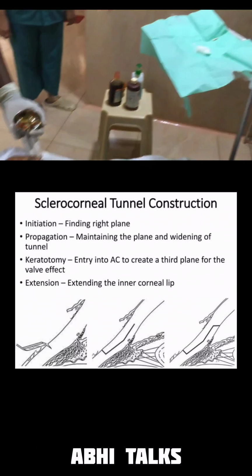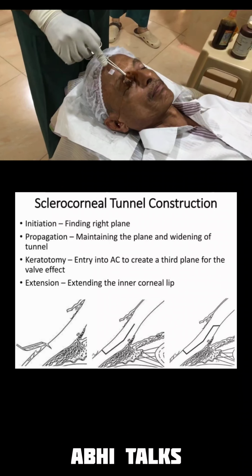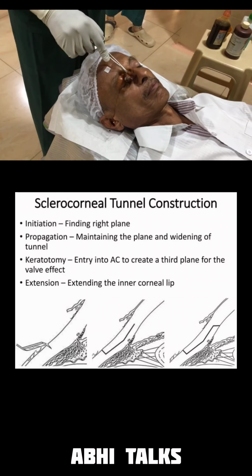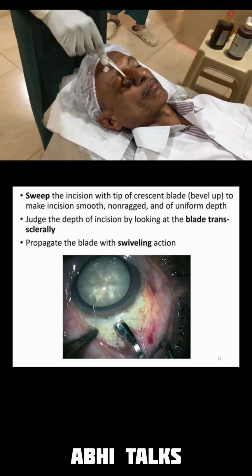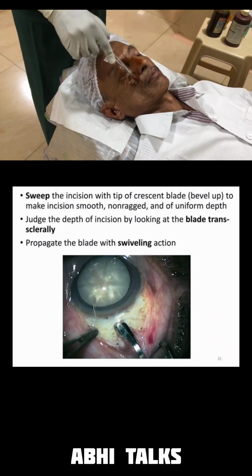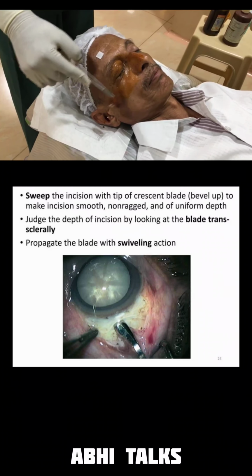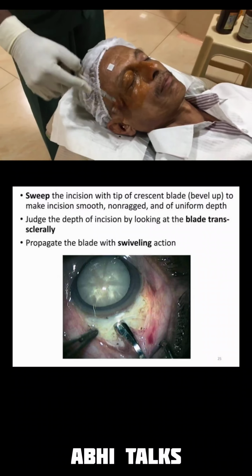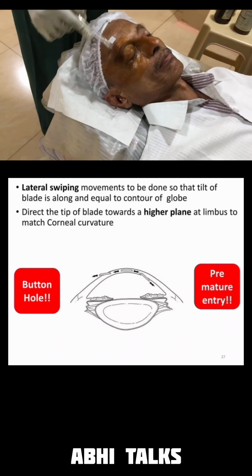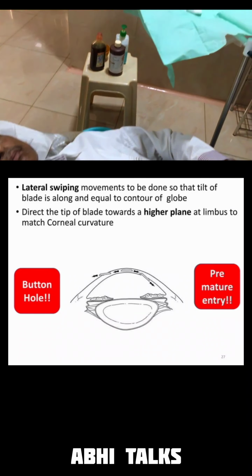Four cotton balls. One is kept dry there, one swab stick, and the eye is kept closed and starting from the central area, the lid margins, lashes, upper lid, lower lid, and circumferentially we will go from center to periphery to clean the entire eye and skin around that. So the painting area covers the bridge of the nose, the malar area, the temple, and the brows, and up to the hairline in the forehead. And he'll discard that and he'll take the second one and the third one.